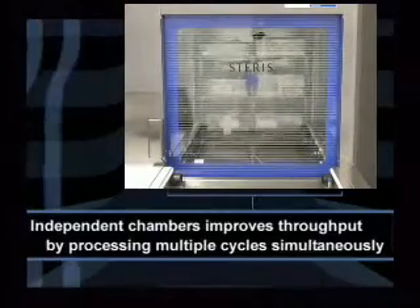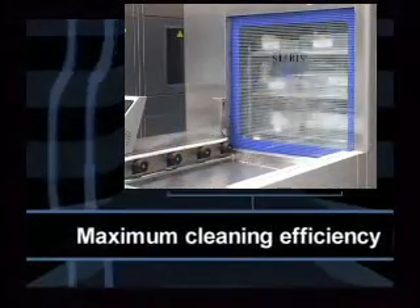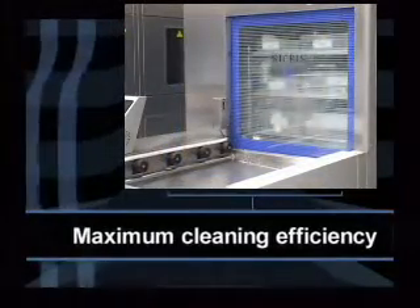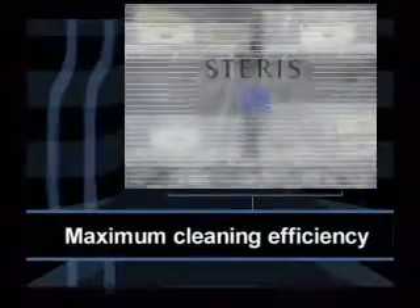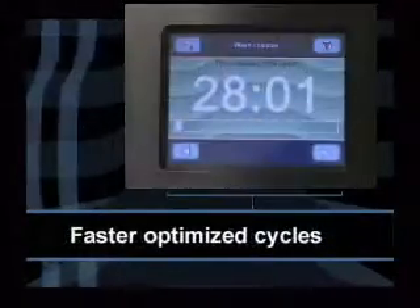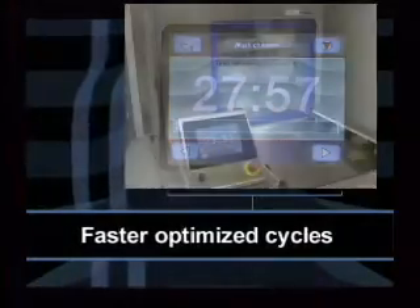Independent chambers improve throughput by processing multiple cycles simultaneously. Maximum cleaning efficiency better prepares instruments for successful sterilization, helping to reduce the risk of infection for patients and staff. Faster, more optimized cycles allow racks to exit as fast as every 10 minutes.